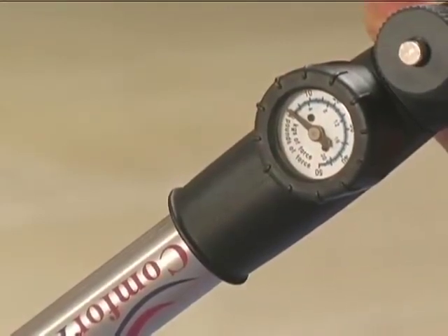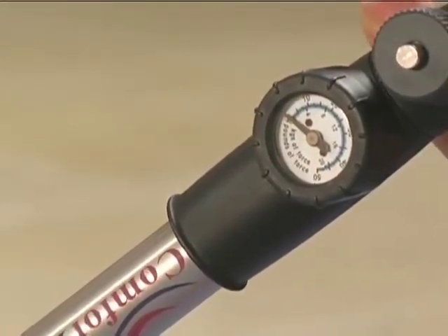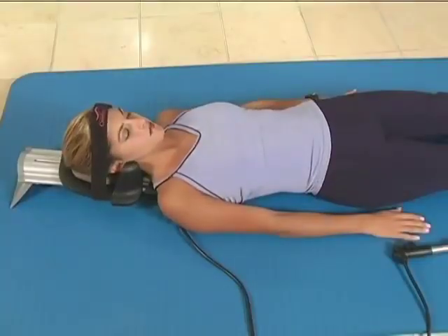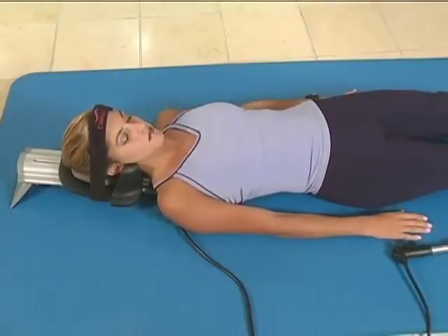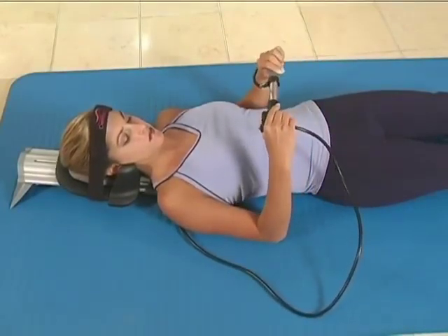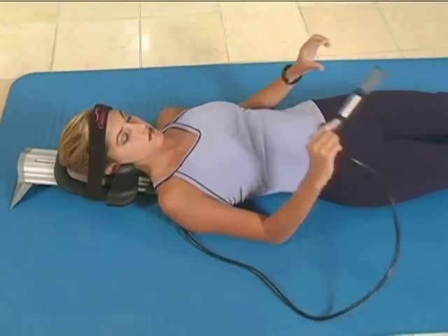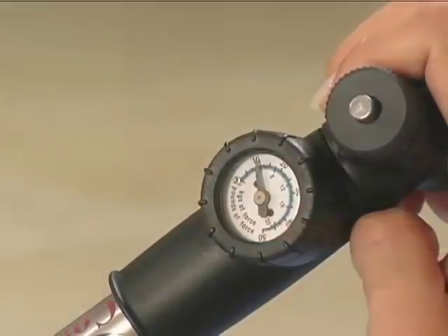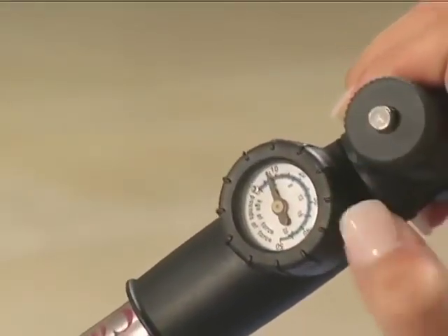ComforTrac features a high-quality gauge designed to be extremely accurate. If the traction reading drops, it may have been caused by head movement or repositioning. Slowly pump the device back to the desired reading, then relax. Should you pump the device beyond your recommended traction force, press the release button until the correct reading has been attained.